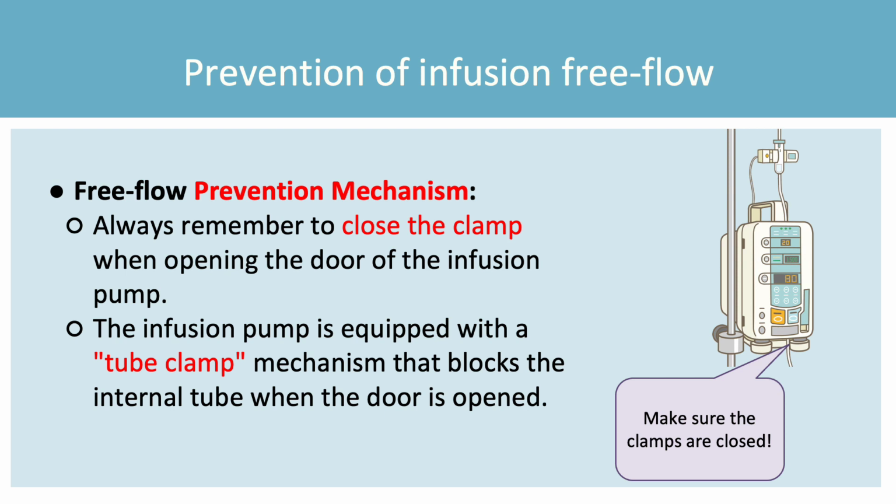In case of emergency due to human error and so on, a tube clamp mechanism is provided to automatically clamp the inner tube when the door is opened. The tube clamp prevents the accidental infusion of a large amount of medication or fluids.